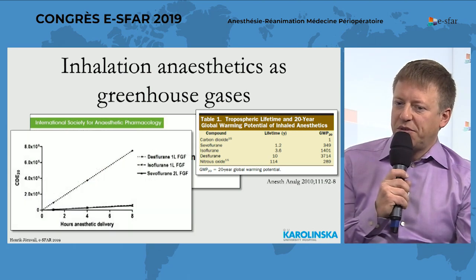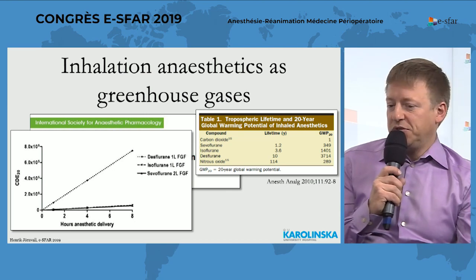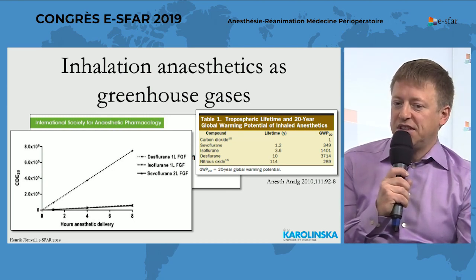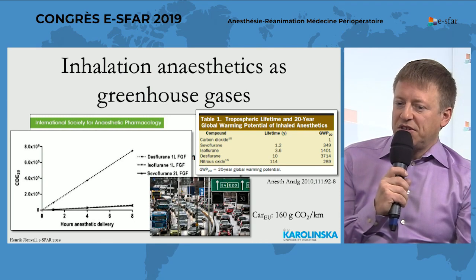And this is pure math again. Given that desflurane needs 6% and sevoflurane only around 2%, you can see that the carbon dioxide equivalent is huge if you use desflurane at a relatively high flow. And the question is, does this matter?